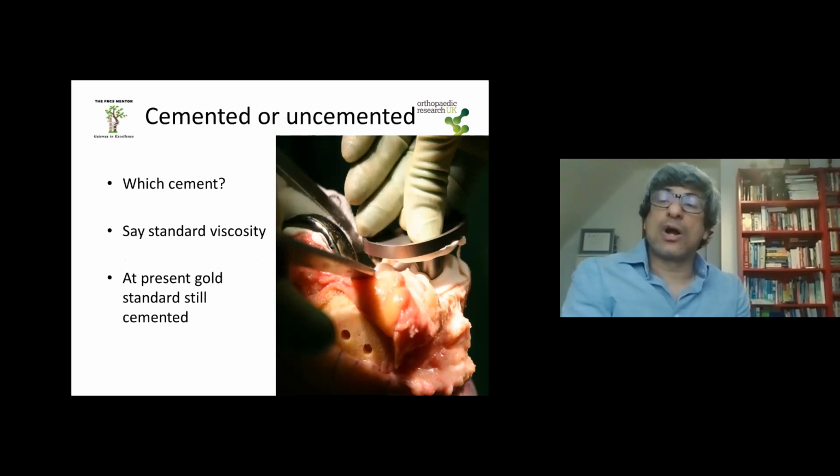Going back to our premise of long-term survival studies and patient-reported outcome measures, we can clearly say, at least at the present time, the evidence is strongly in favor of cemented knees. Of course, there are surgeons now using uncemented knees with good follow-up, but as a basis, most surgeons at the moment, the evidence would be to use cemented implants.